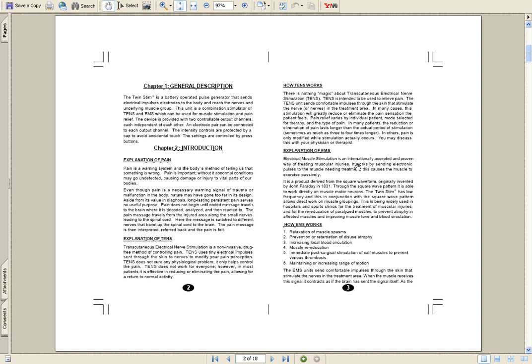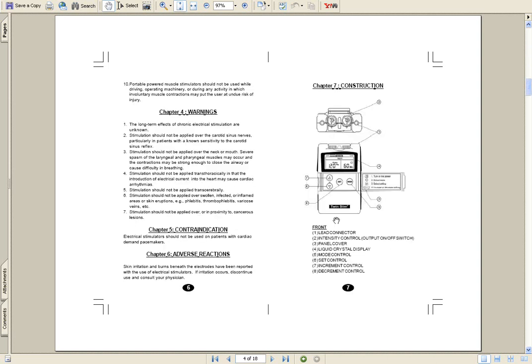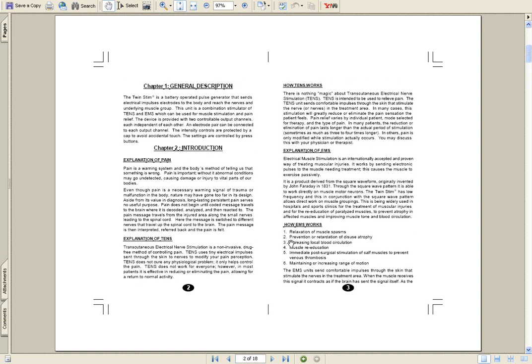But I recommend, again, you can just pause these tutorials and take a minute or two to read how it works. It's a relaxation of muscle spasms. Sometimes you put the electrodes exactly on where the muscle is spasming, and then you turn up the device. You can either put it on constant, where it just contracts it for a certain amount of time, and then the muscle fatigues, quit spasming. Or you can set it up on a cycle where now the electrical muscle stimulator is controlling the contraction and release of the muscles to try to help with muscle spasms.